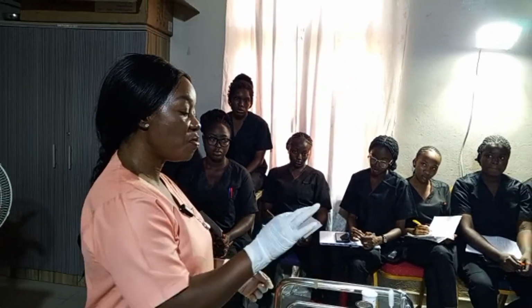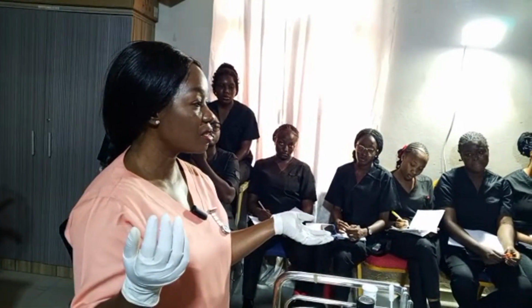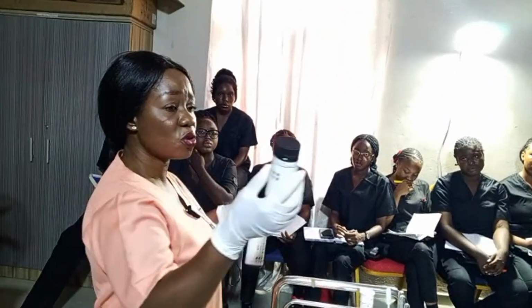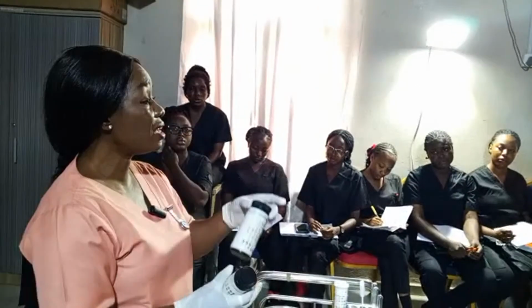Then we remove what? What's the next thing? And then the other one is what? You either use Combi 9, or you can also use Combi 2. The advantage of Combi 9 is that it contains lots of chemicals, so you can carry out the tests at the same time, right?